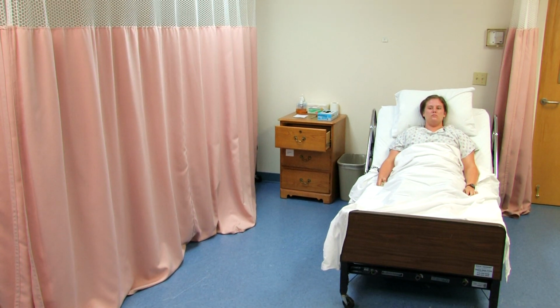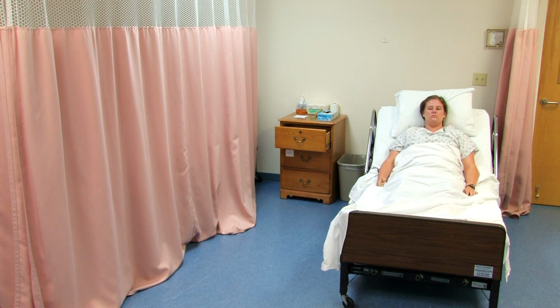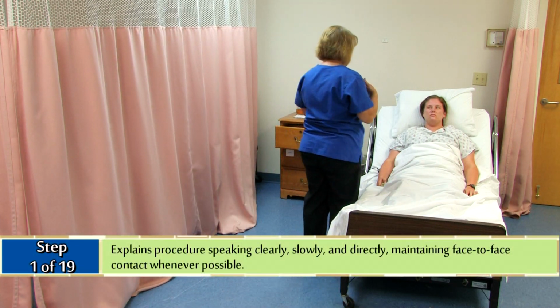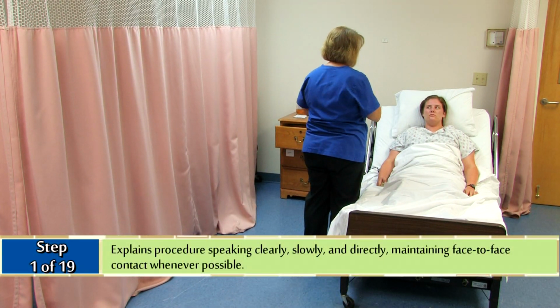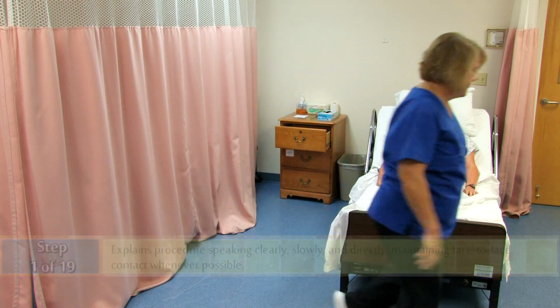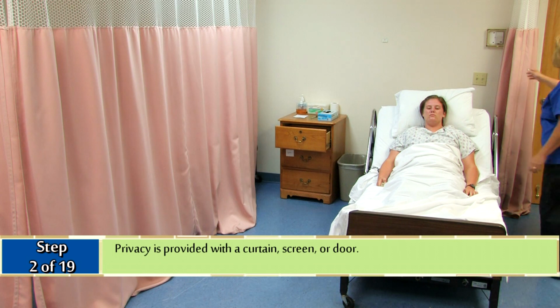Transfers from bed to wheelchair using transfer belt. The candidate enters the room and approaches the client, explains the procedure, speaking clearly, slowly, and directly, maintaining face-to-face contact whenever possible. Privacy is provided with a curtain, screen, or door.